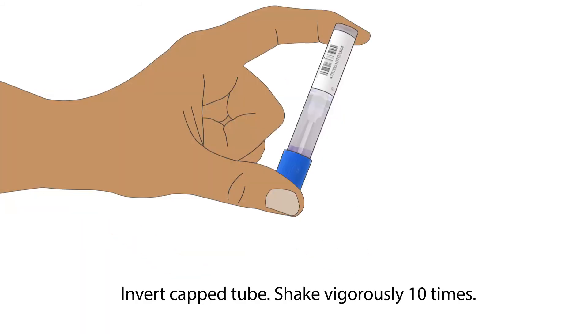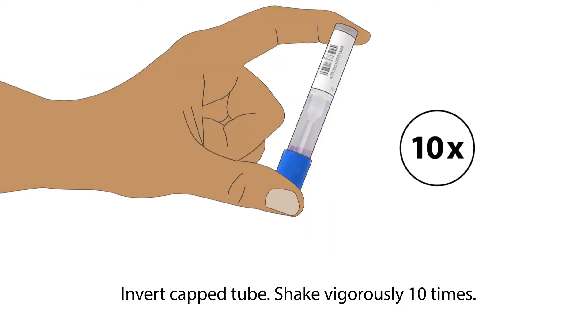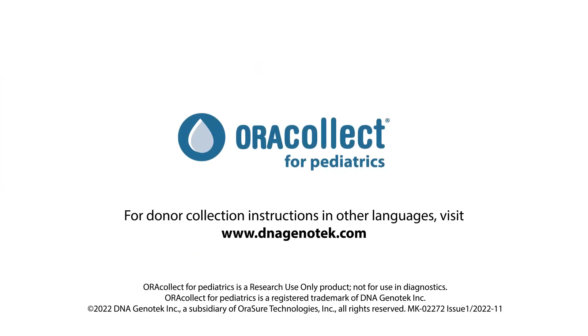Invert the capped tube and shake vigorously 10 times. AuraCollect for Pediatrics is an easy, non-invasive way to collect and stabilize DNA from pediatric donors.